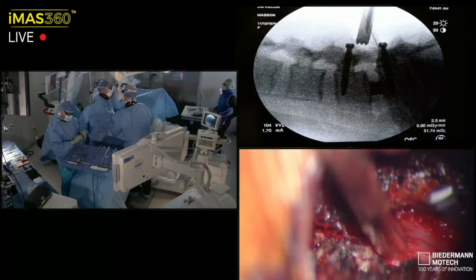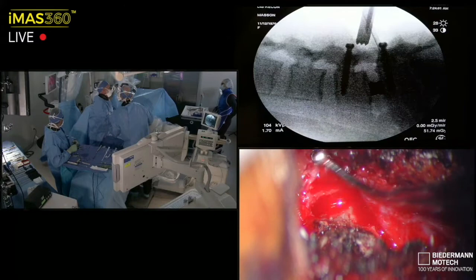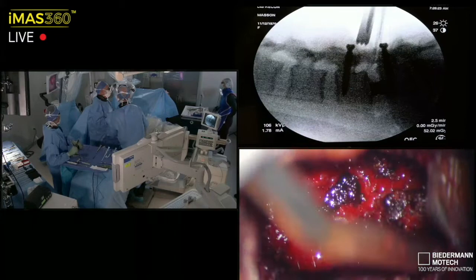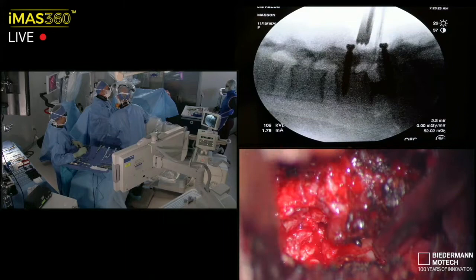Let me see how that foramen feels. All right, here's L5. It's pretty wide open. And then when we go up here, we know that this is medial pedicle, and I've drilled it all down. Here's lateral thecal sac boundary. On the left side, I'm above the disc space. So we know those images we saw pre-op have been accounted for, at least relative to the harder tissue. Still got all this scar. And again, this space is here. We have a straight pituitary.